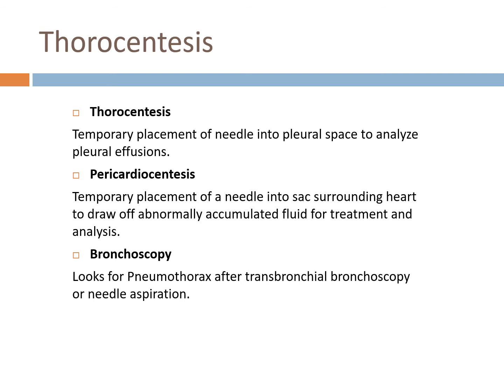Sometimes if we do take that biopsy, then we have the risk for an air leak and then a pneumothorax. So if we've gone in to do a transbronchial biopsy, or we've gone in with a needle and either snipped off a piece or aspirated off something, then we definitely need to do a chest x-ray after these procedures to make sure the lung is still inflated.